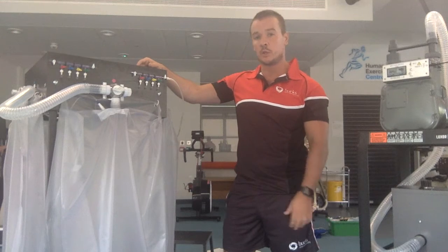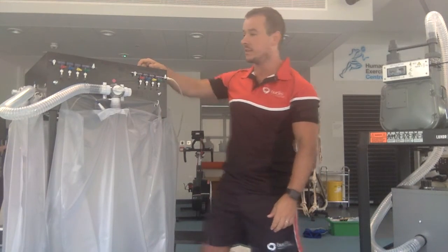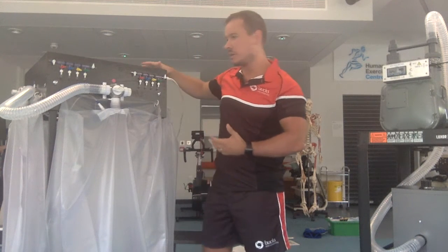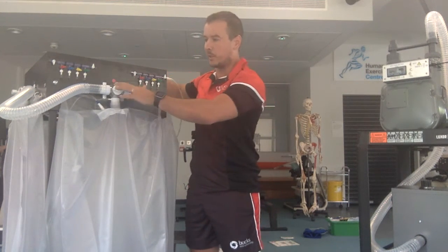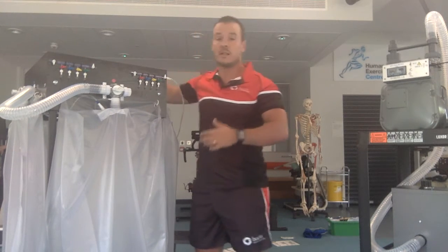If I want to use the blue Douglas bag, I ensure that the red bag is sealed and I open the blue bag. If I want to use the yellow bag, I ensure that both the red and the blue are sealed and I open the yellow bag, and so on.